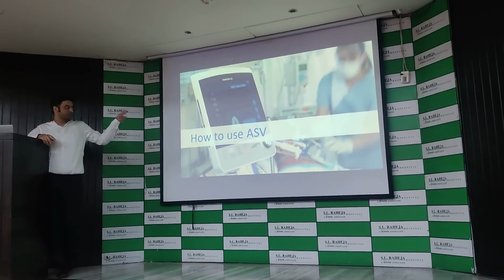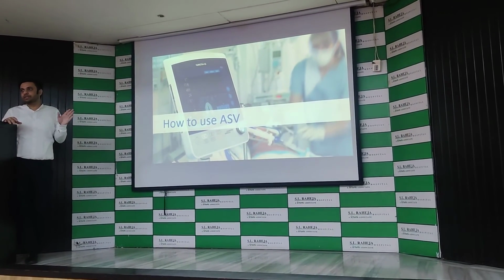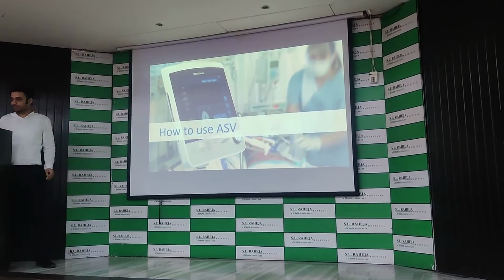But we have attached the normal lung patient in ICU. So it always remained in the middle because it was a normal lung and no lung condition. So the entire time the safety box was at the same place.